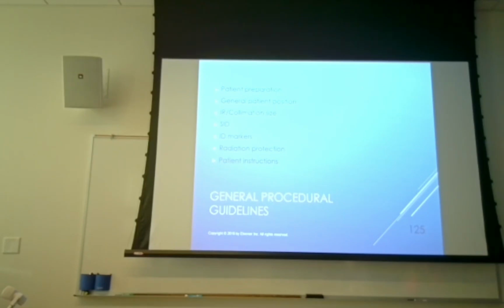Thick waistbands are going to show up. Snaps, buttons, all that kind of stuff are going to show up as well. So you need to kind of get that stuff out of the way. So dress your patient for the procedure, if at all possible. If they're on a backboard, of course, that doesn't really apply. You may have to deal with seat belts and all kinds of other stuff as well. Okay. So patient preparation, just get all the artifacts out of the way.